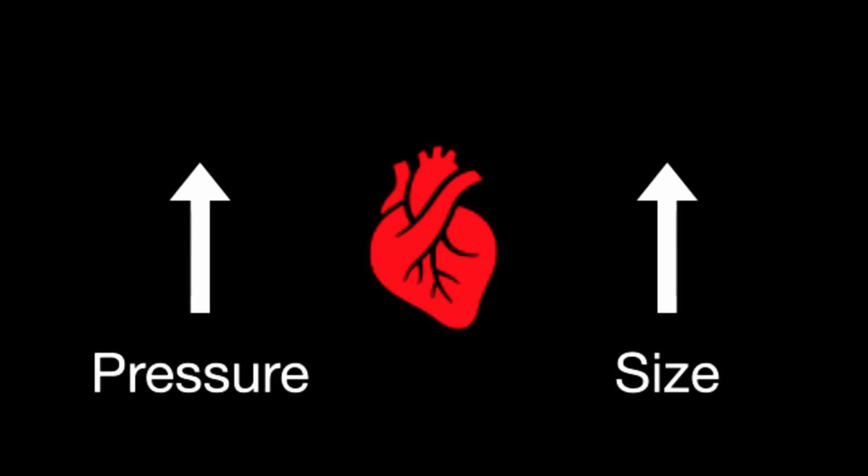No, that's great. I think that's really helpful to think about it in terms of the acute versus chronic. The right heart has its ability to function to a maximum degree in the acute phase. And we're going to see this come into play later in the talk today, as we talk about some of the Doppler parameters, but knowing that it can only up its performance so much in the acute phase is really going to be helpful in learning that distinction.